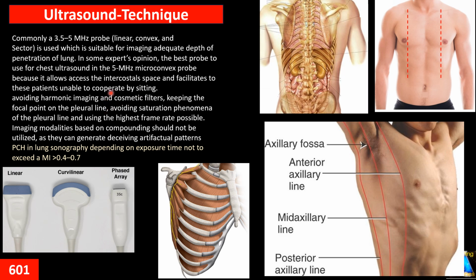Generally, we shouldn't hold our probe too long in any specific spot, especially in neonates. When we need it, just a few seconds, get the image and freeze it. In that time, the ultrasound is off. There is no sound, so we decrease the exposure time to the ultrasound.